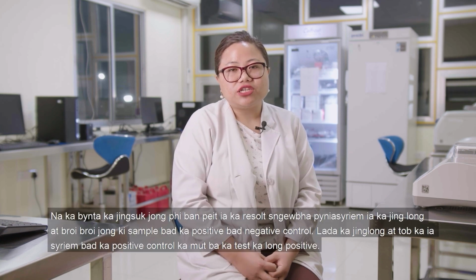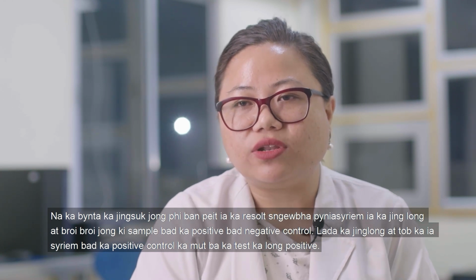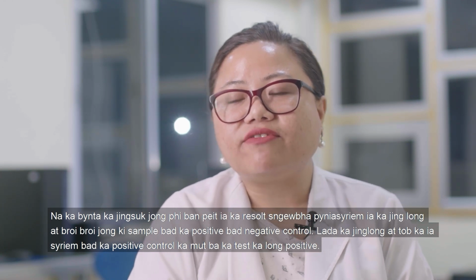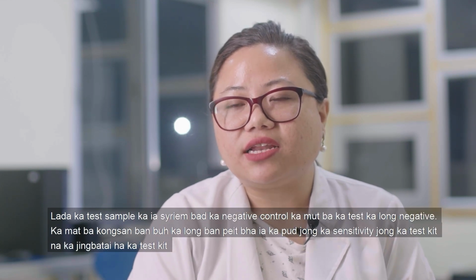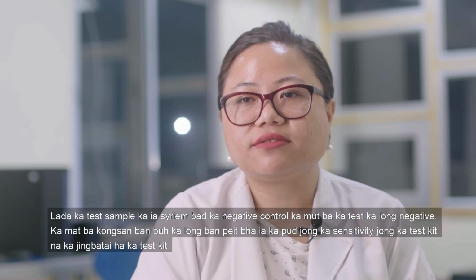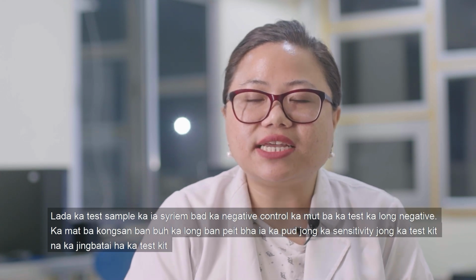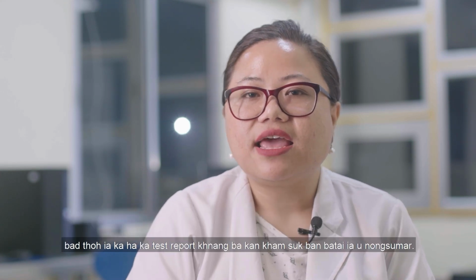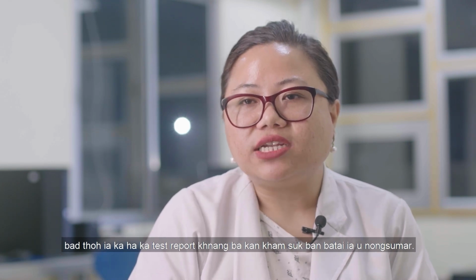For easy interpretation of the results of the test samples, please compare clumping with the positive control and the negative control. If the clumping resembles that of the positive control, it's a positive test. If the clumping resembles that of the negative control, it's a negative test. An important side note, please check the sensitivity limit of your test kit from the kit insert and mention it in your test report in order to make interpretation easier for clinicians.